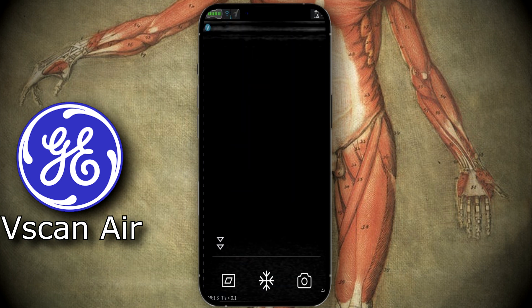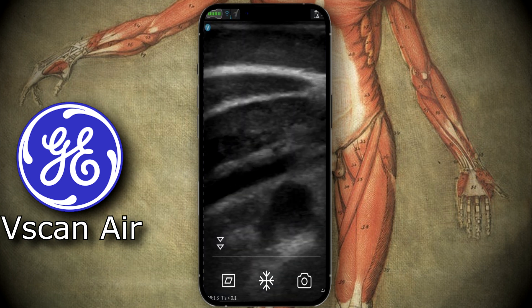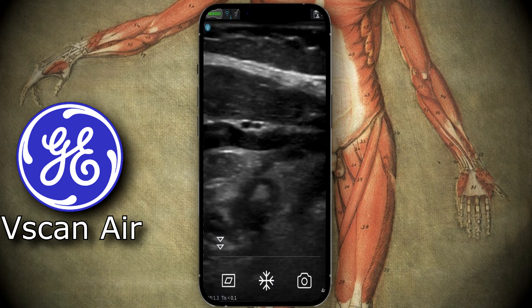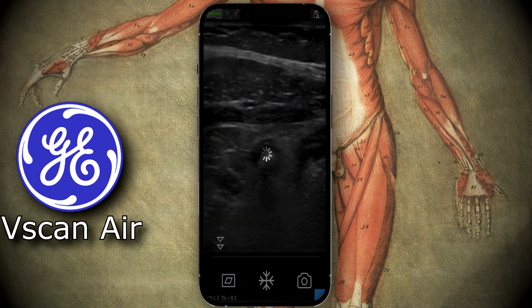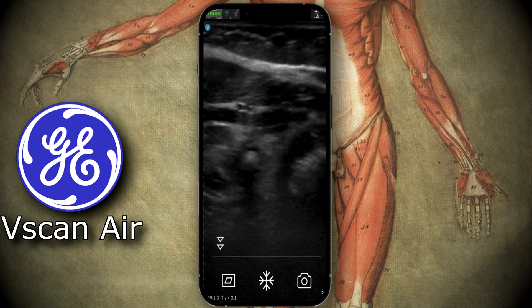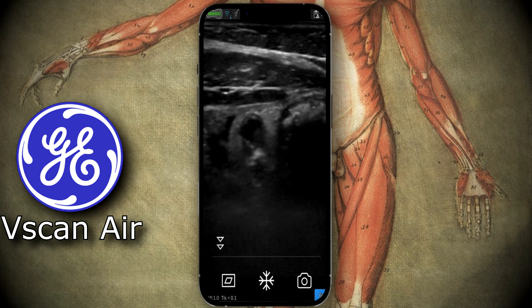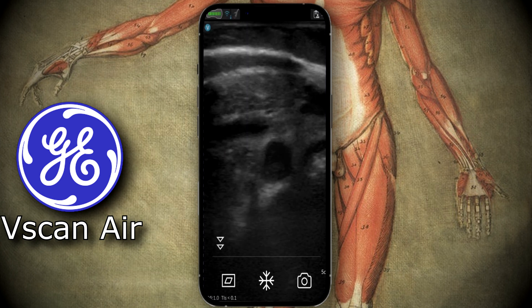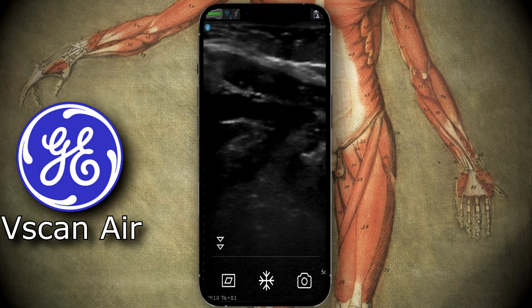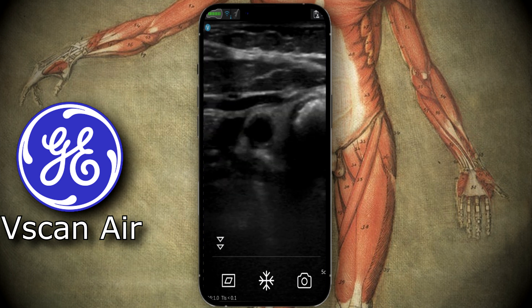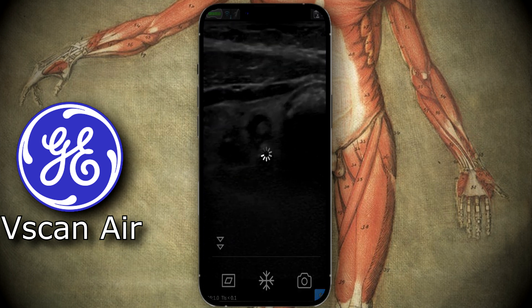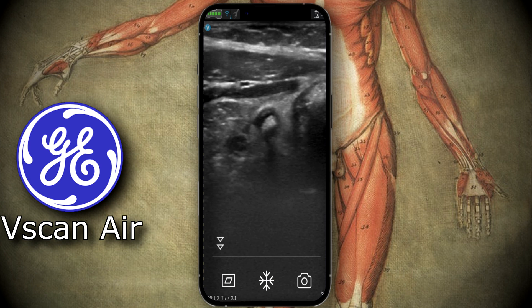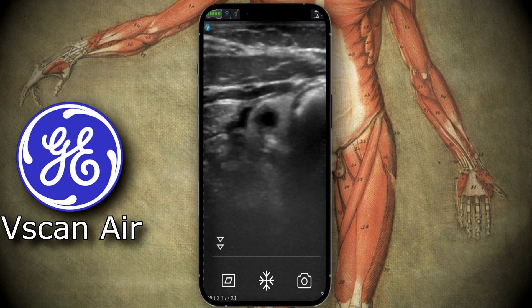I chose the vascular setting because it's more contrasty, but you can use the musculoskeletal or small parts setting. Right off the bat you can see the appendix right there with an appendicolith. The appendix is right under the oblique muscles. I'm going to raise the gain — you can see the appendicolith is shadowing.